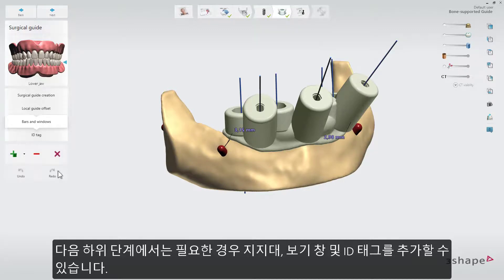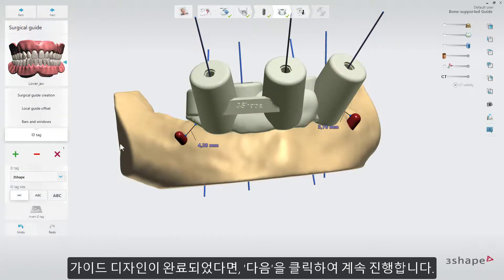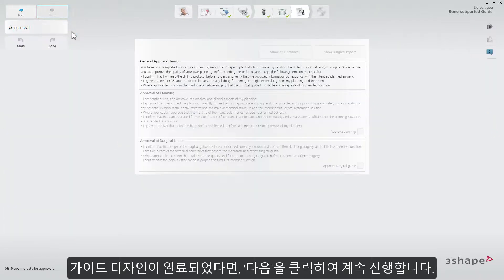Further sub-steps let you add bars, windows, and ID tags if needed. When you are satisfied with the guide design, click Next.